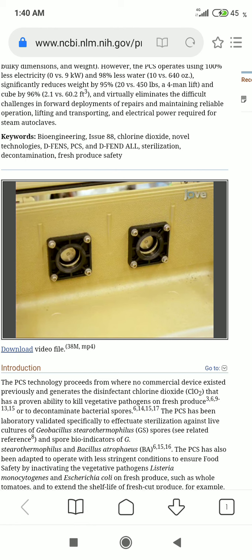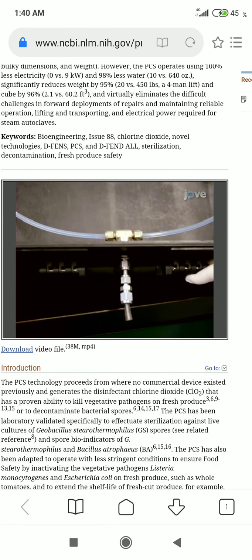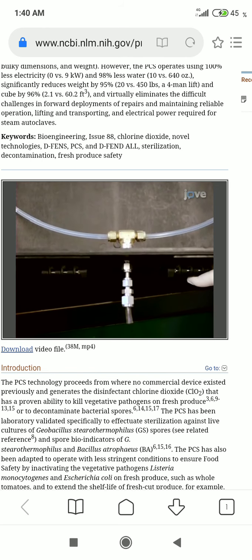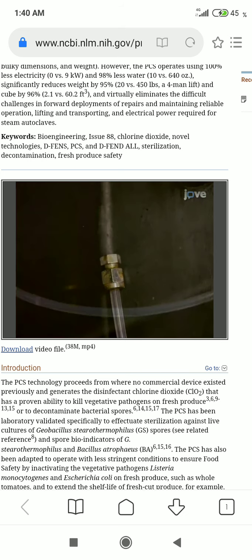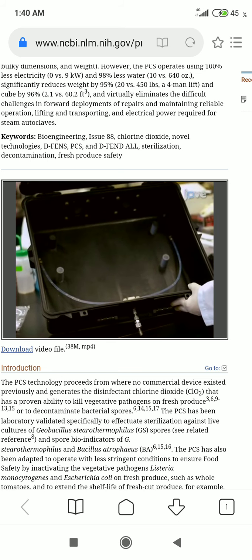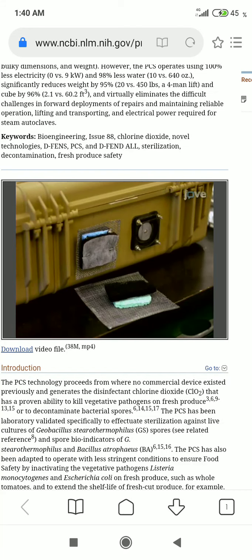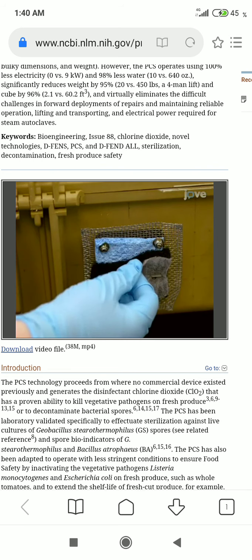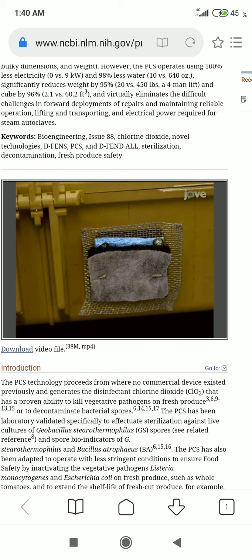cycle. A filtered inlet valve is installed in the front of the suitcase to allow an inflow of air by pumping, particularly for flushing the PCS chamber after a chemical sterilization cycle is complete. A circulating tube is connected to the inlet valve and helps distribute incoming air uniformly throughout the chamber. Homemade disposable scrubbers engrafted over the outlet valves filter and remove sterilant and other hazards, and thereby ensure the health and safety of users and protect the environment.